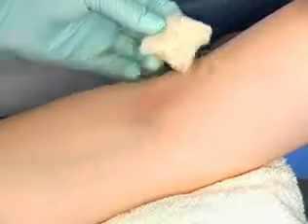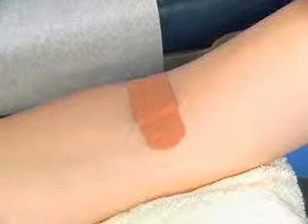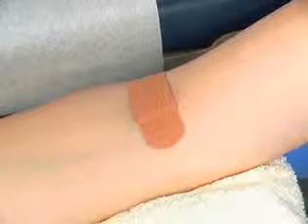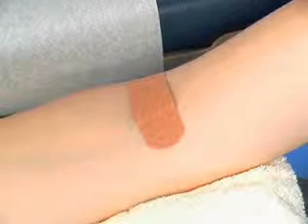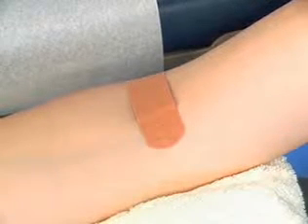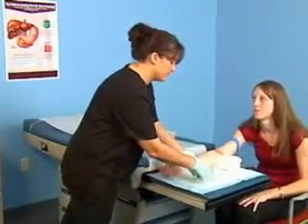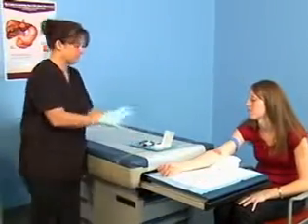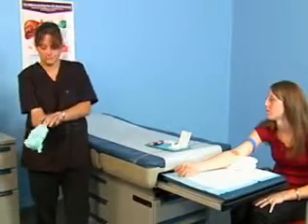Remove the gauze and inspect the puncture site to ensure that the opening is sealed with a clot. Apply an adhesive bandage to the puncture site. As an alternative, the gauze pad can be folded into quarters and taped on the puncture site to be used as a pressure bandage. Instruct the patient not to pick up anything heavy for about an hour. Lifting a heavy object causes pressure on the puncture site, which could result in bleeding. Remove your gloves and sanitize your hands.